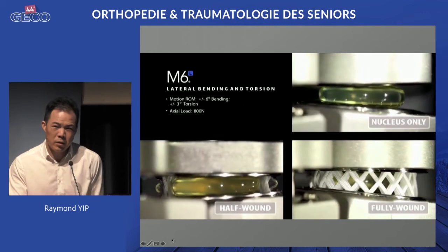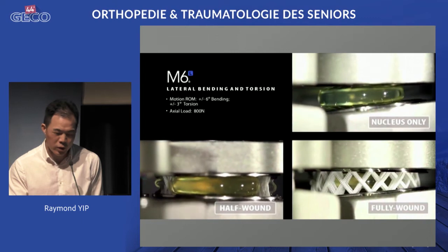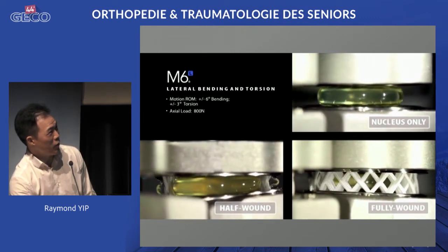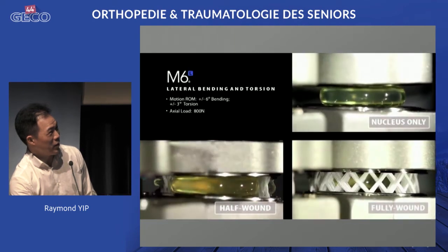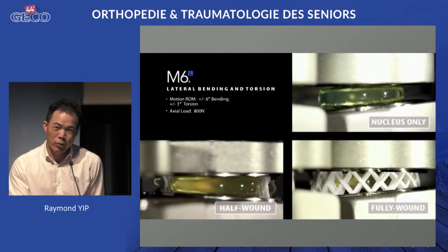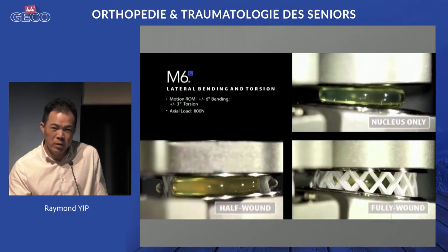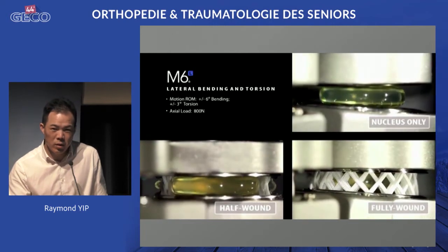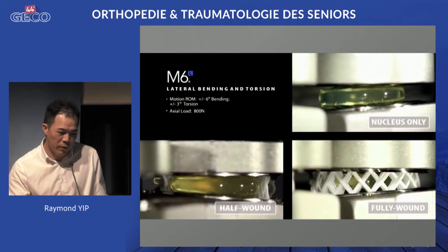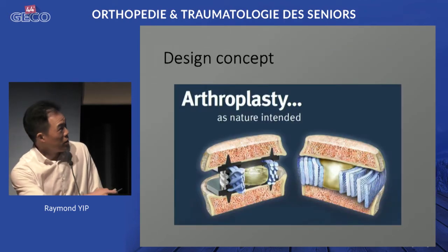And this next slide is interesting. This is a disc design that was designed to be like the human disc. However, if you look at the fibers here, you see they're actually moving. And this is possibly going to fray, like a rope that's going over a pulley. If you do that over several million cycles or several hundreds of thousands of cycles, you may actually see these fibers fatigue. And I think that may be the mode of failure of this device. And then the core will probably just fall out.